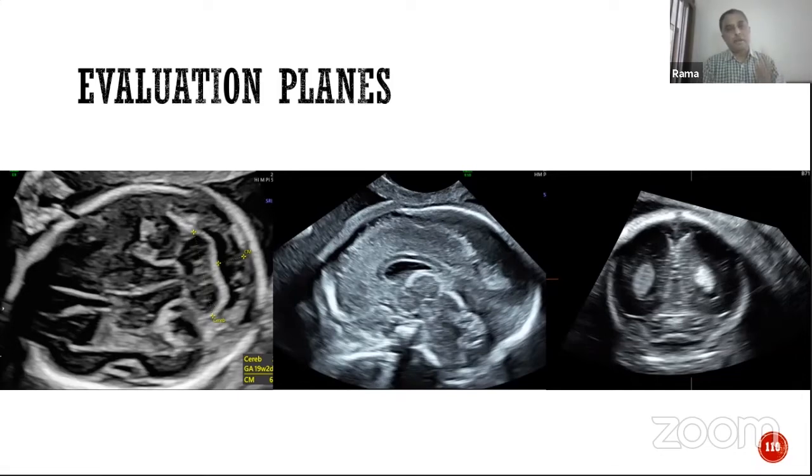And even in this one plane, seemingly one plane, we should realize that there is a little cephaloid cut which takes you through what is seen in the picture now. You see the two hypoechoic cerebellar hemispheres, and you see a relatively hyperechoic vermis sandwiched between the two. So the dumbbell-shaped cerebellum is classically seen in this particular view, and behind, the space of CSF seen behind the cerebellum is the cisterna magna, and behind that is the occipital bone, and then the nuchal fold thickness if you're within the window of the second trimester genetic sonogram.